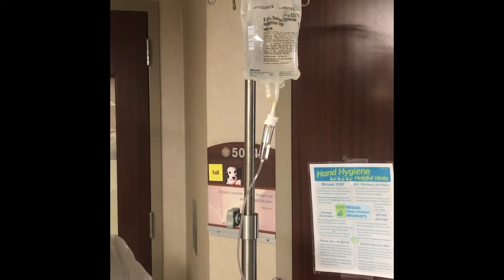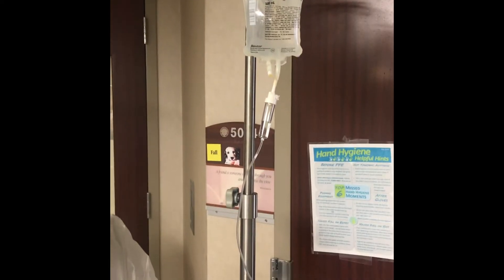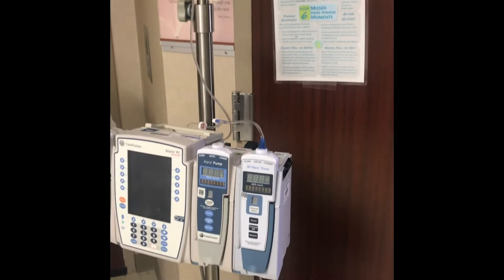This is our setup for how to maintain and manage a patient while outside of the patient's room. Here's our IV pole with our pumps hooked up to the regular IV tubing just like we're supposed to.